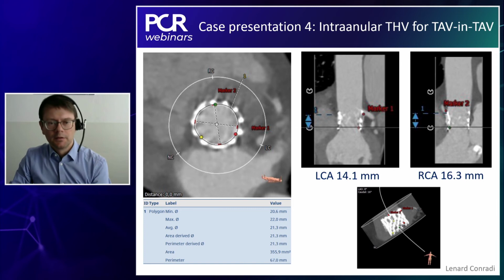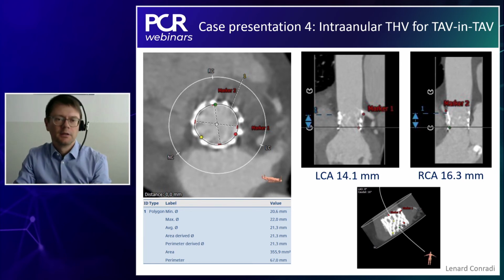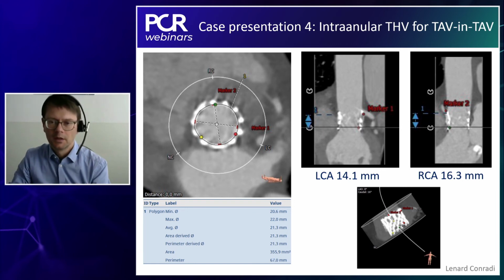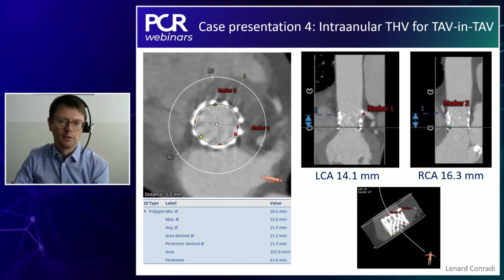Yeah, usually when we do valve-in-valve procedures, we also prefer supraannular designs. But I think in this case, it's probably not much of a benefit. If you have a tubular anatomy, there's no chance that the supraannular design has more space to expand compared to, you know, after treating a Hancock or somewhere where you push out or have some valve remodeling by a balloon valvuloplasty after implantation.